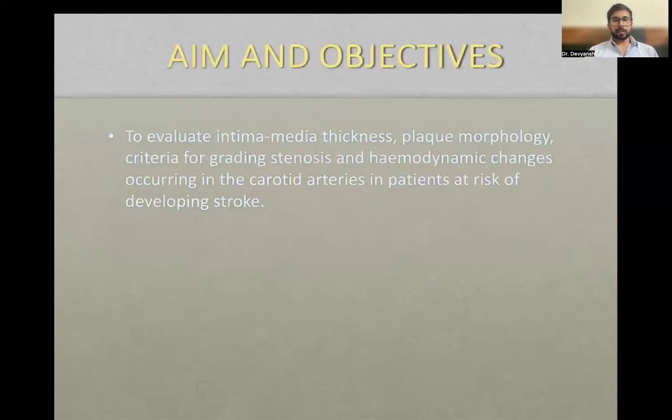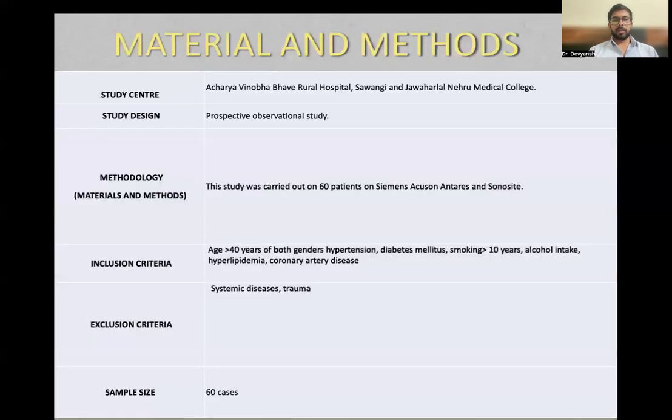Aims and objectives: to evaluate intima media thickness, plaque morphology, criteria for grading stenosis, and hemodynamic changes occurring in the carotid arteries in patients at risk of developing stroke.